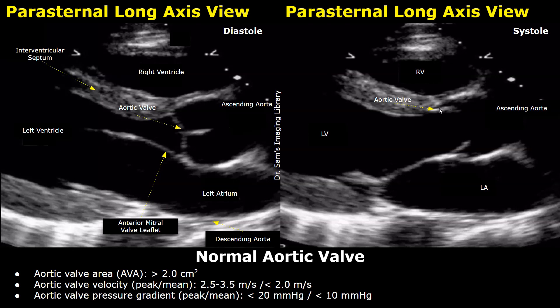We can measure the aortic valve area, the peak and mean blood velocity across the aortic valve, and the peak and mean pressure gradient on echocardiography. The normal aortic valve area is greater than 2 cm². The peak valve velocity is between 2.5 and 3.5 m/s. The mean velocity is less than 2 m/s. The peak aortic valve pressure gradient is less than 20 mmHg and the mean pressure gradient is less than 10 mmHg.